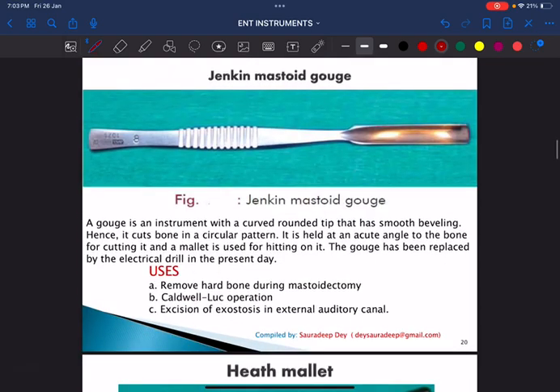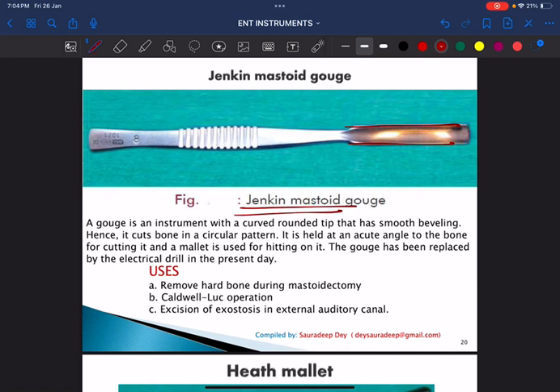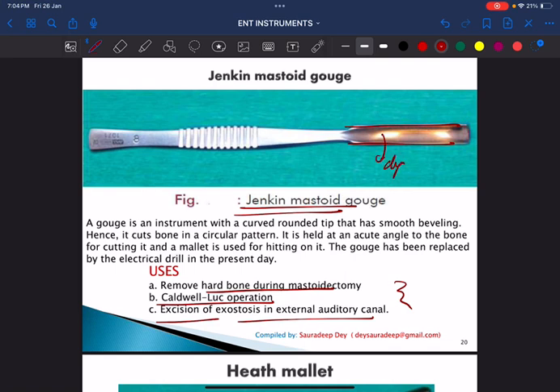This is called the Jenkins mastoid gouge. You can see a straight structure with a tunnel or canal/depression. It is mainly used to remove hard bone during mastoidectomy, and also for Caldwell-Luc operation and excision of exostosis of the external auditory canal. Exostosis is one of the most common benign tumors of the external auditory canal.